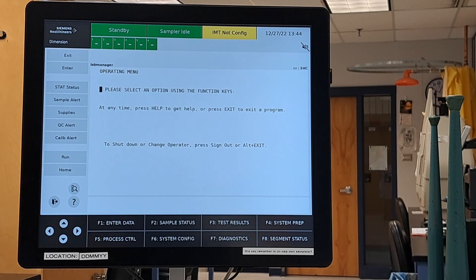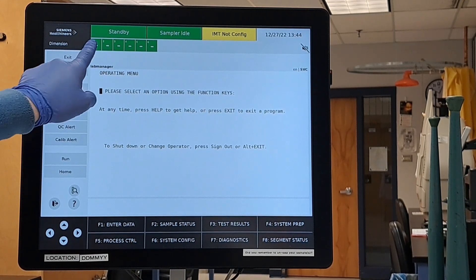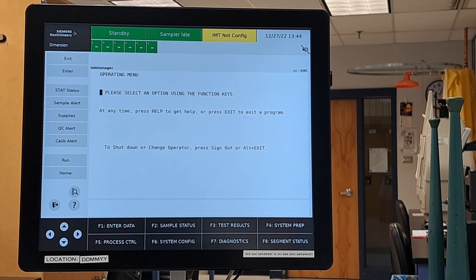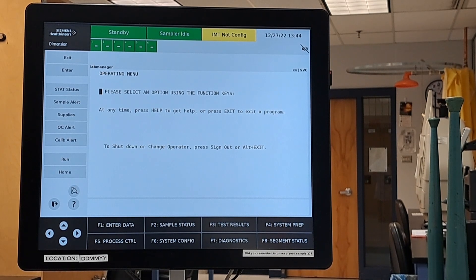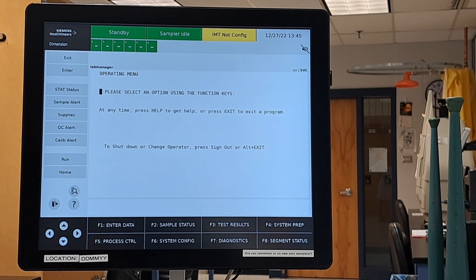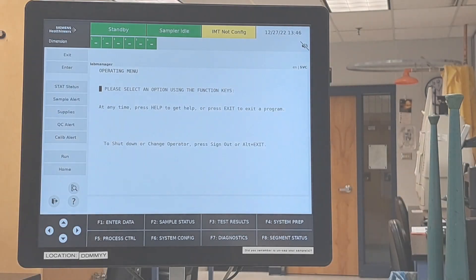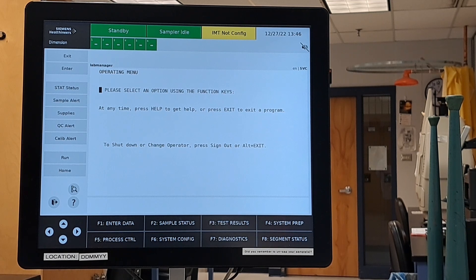This is the main screen of our EXL, showing us the status of our analyzer, our sample probe, and our IMT module. Our segment wheel has six sections associated with it, represented by each of these boxes — the dashes would be replaced by the assigned letter of the segment when it scans it in. These will pop up in yellow if there are any alerts regarding the sample, supplies, QC, or calibration. Run allows us to start the analyzer. Home allows you to go directly to this page no matter where you are. For the sake of your labs, you will be most focused on the top four options in your menu: enter data, sample status, test results, and system prep.